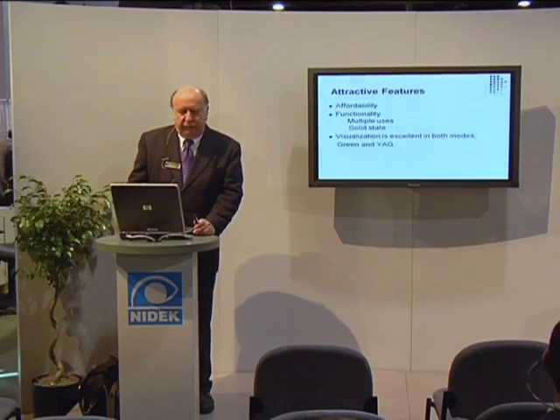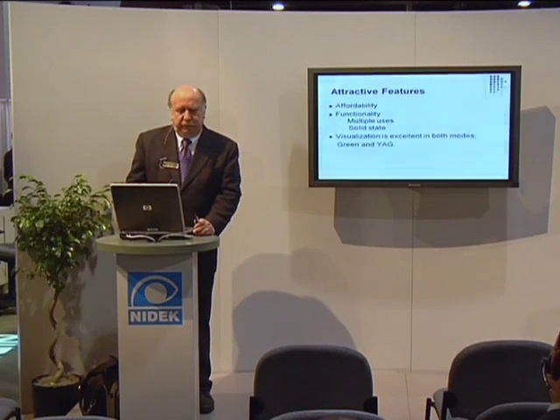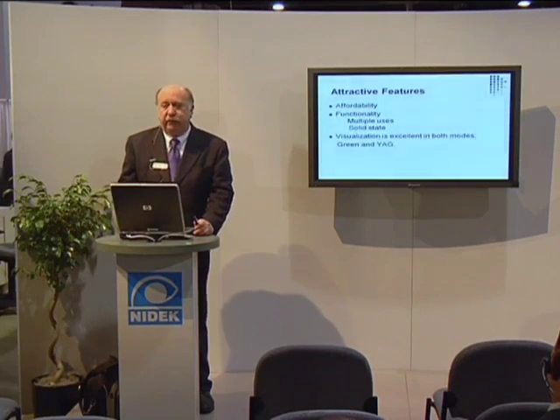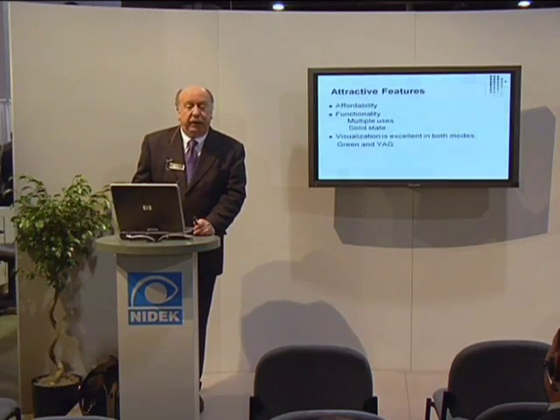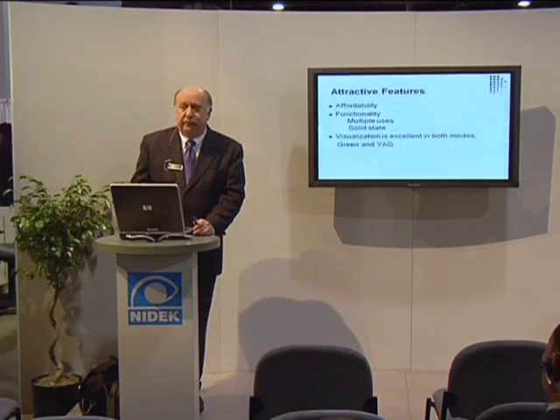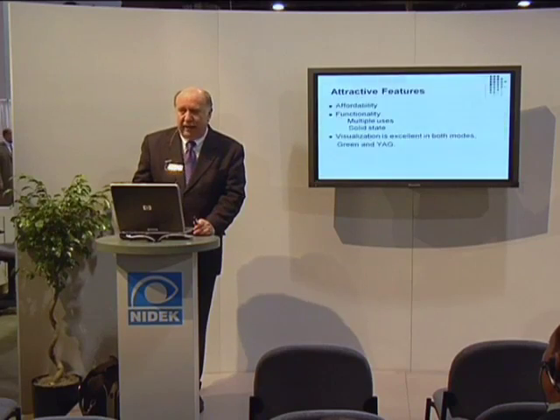So the functionality is that it has many uses, right? What are the uses for the 532, and what are the uses for the YAG? We know the YAG is for capsulotomies and for iridotomies. We know that the 532 is really for retinal photocoagulation. It's also for glaucoma, and for glaucoma, that's for laser trabeculoplasty, LTP or ALT, whichever you like, they're synonymous. And the visualization, thanks to Mr. Abe sitting in the back, is excellent on both modes.